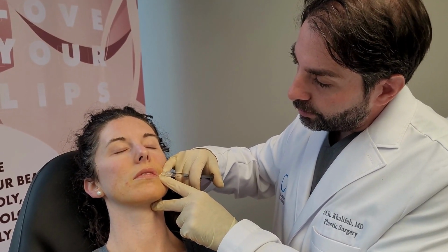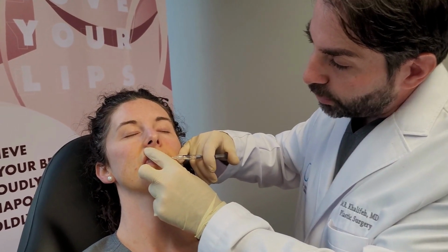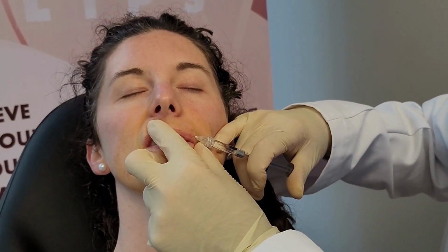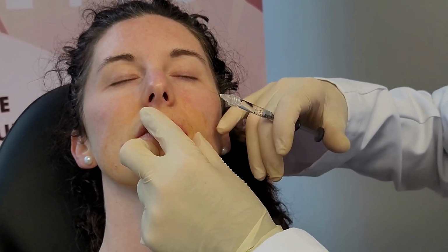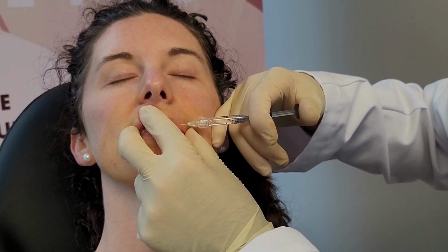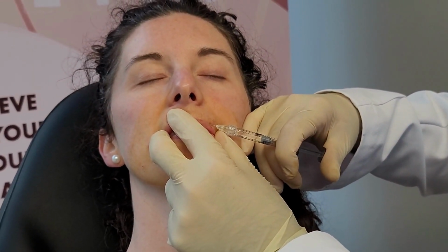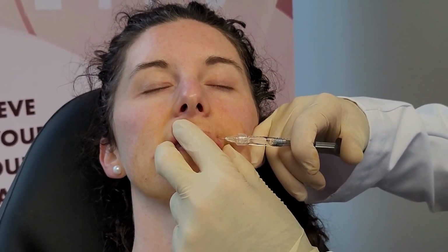The little stick. Now I like to use a fanning technique. Fanning means we go one puncture site, and with that single puncture site, do one vertical line, one angled line, and one horizontal line. Then we're going to work our way medially doing that. Okay, one vertical line. Again, you can inject fillers in many directions. You can change the name every time you vary the direction into a different technique, but the important thing is to have a good eye and to inject slowly.